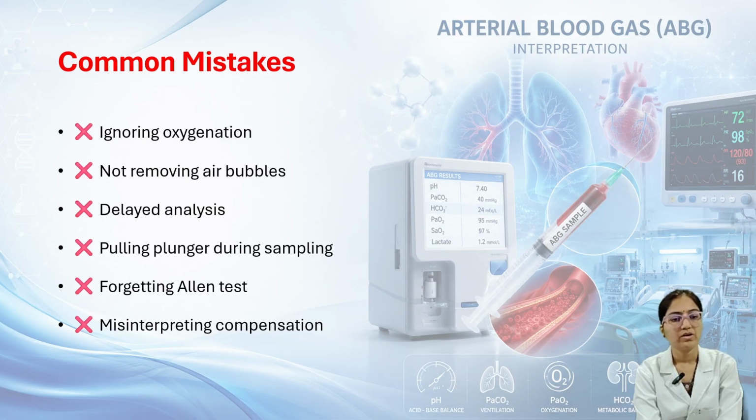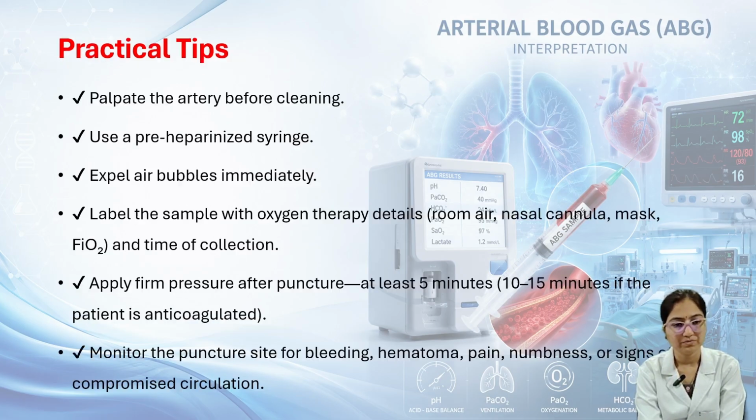Next, common mistakes you need to avoid: ignoring oxygenation, not removing air bubbles, delayed analysis, pulling the plunger during sampling, forgetting the Allen test, and misinterpreting compensation. The Allen test is a must to perform. These are the common mistakes we need to avoid.